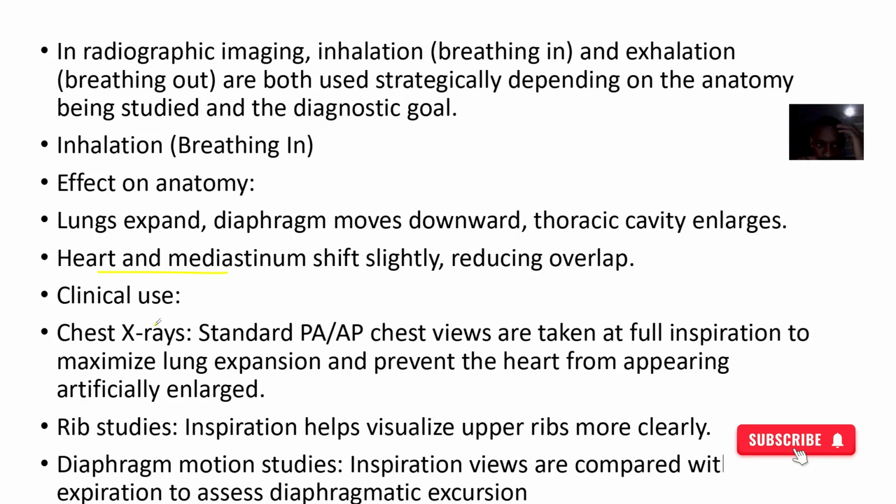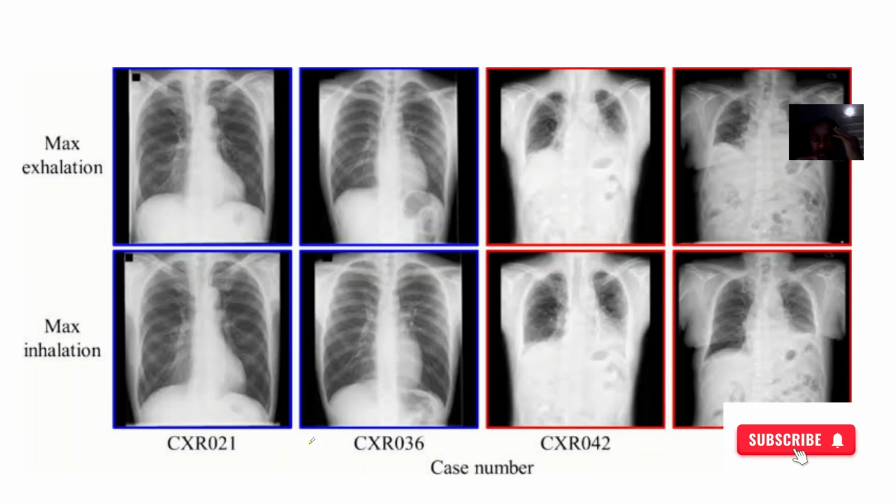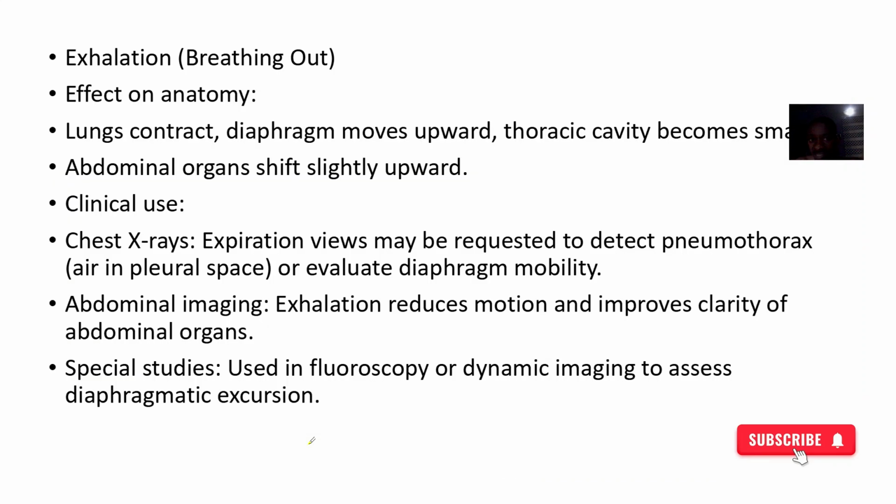The clinical use is in chest x-rays, for the study of ribs, helping to visualize the upper ribs more clearly, and also studying the diaphragm, diaphragm motion studies. So these are different images taken when the patient was inhaling and when the patient was exhaling.